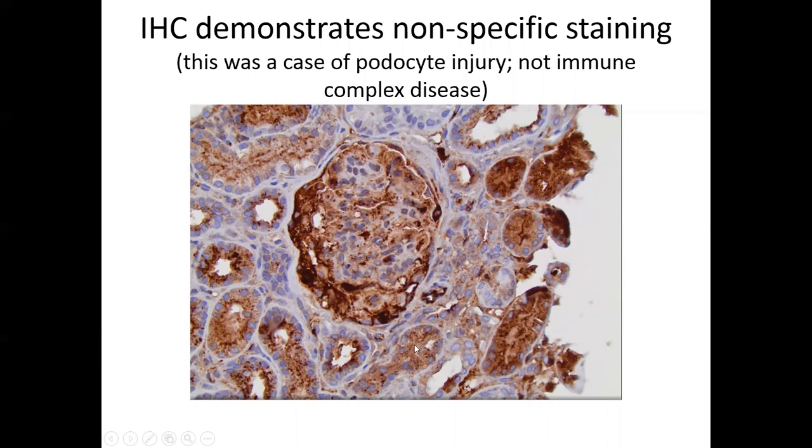We're still trying to tweak this to see if we can get a better granular staining pattern, because it would be wonderful if we didn't have to use fresh frozen, OCT embedded specimens. But I can tell you, we've tried multiple different preparations, multiple different types of incubations, and multiple types of antibodies, and none of them have seemed to be working. And in human medicine, they don't trust this, they only trust the IF. Unless you're from Europe, apparently they trust it in Europe.